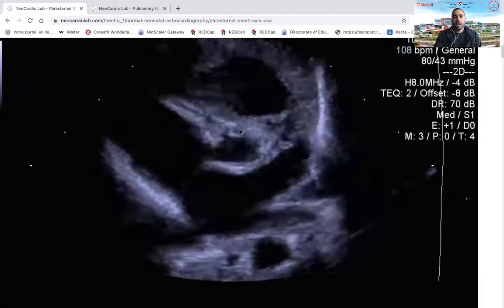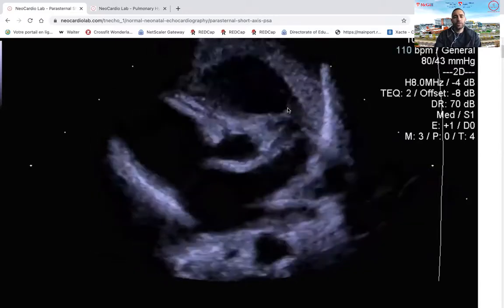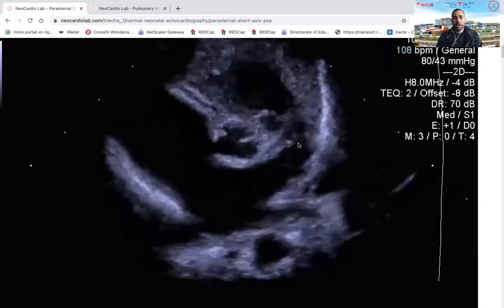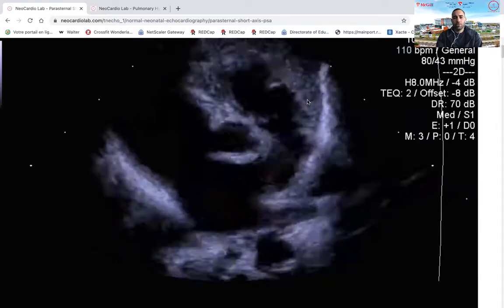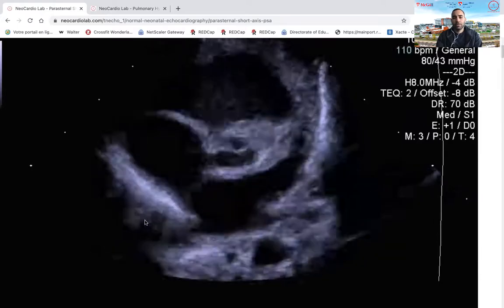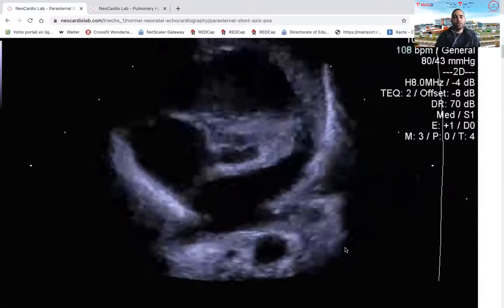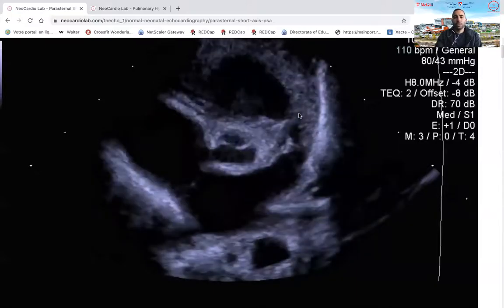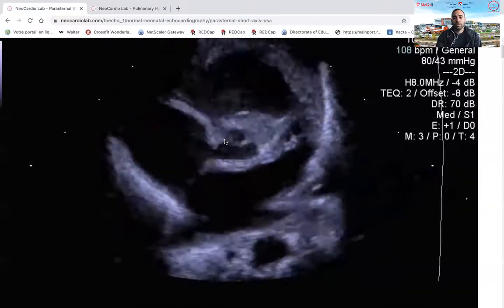If we see here, our aortic valve is placed centrally, and this is your pulmonary valve that we can see occasionally during the cardiac cycle in this particular view. Of interest, the right side of the patient is here, the left side of the patient is here, and in the normal anatomical configuration, the pulmonary valve is anterior and to the left of the aortic valve.